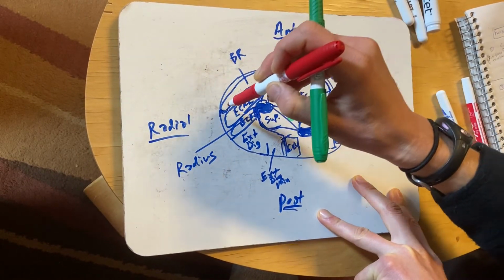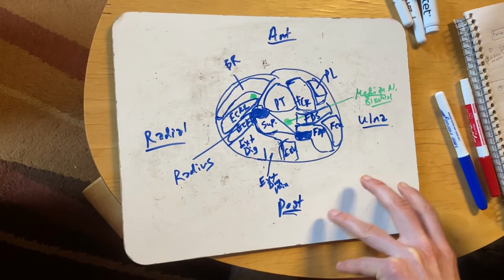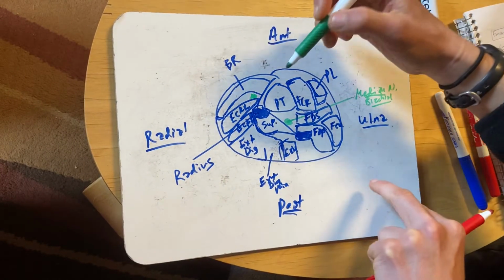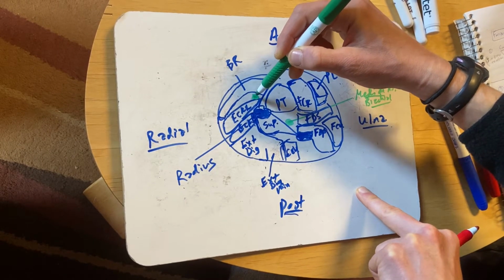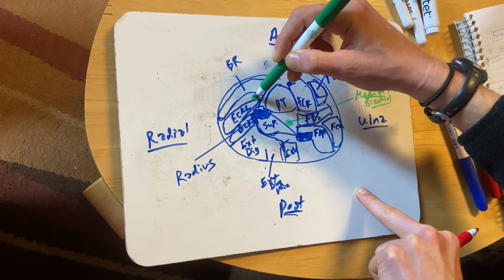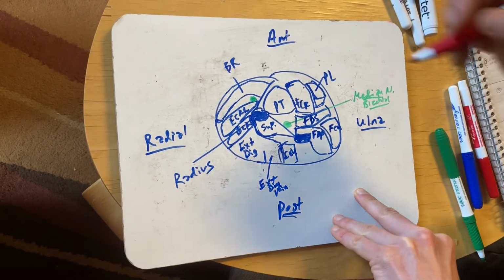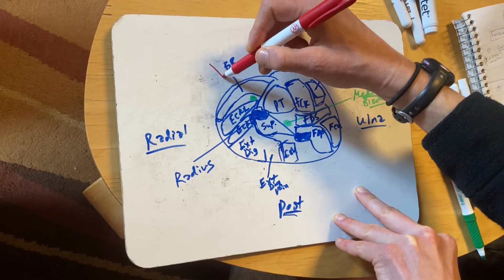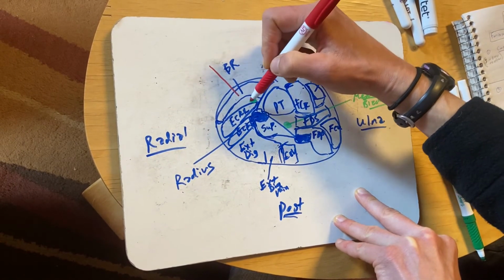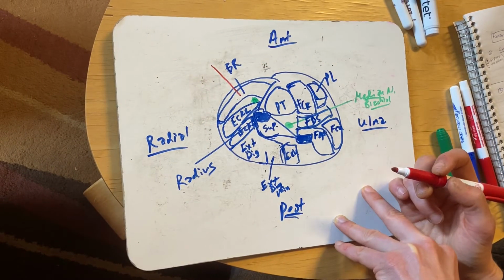So the brachioradialis is going to run right along here in the lateral anterior forearm roughly, and deep to that brachioradialis, distal to the radial head and neck, is going to be the radial nerve. So the radial nerve is right here. I don't want to go too deep when I'm needling the brachioradialis to avoid that radial nerve. So trajectory can be pretty much direct into the brachioradialis, but again, I want to stay superficial. So that would be your needle direction for getting that muscle.